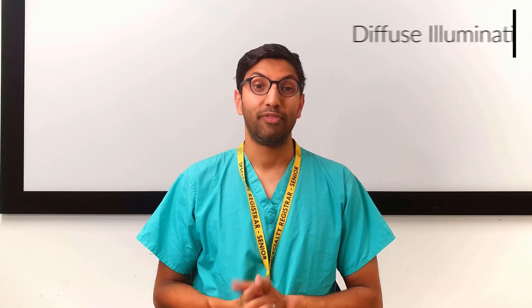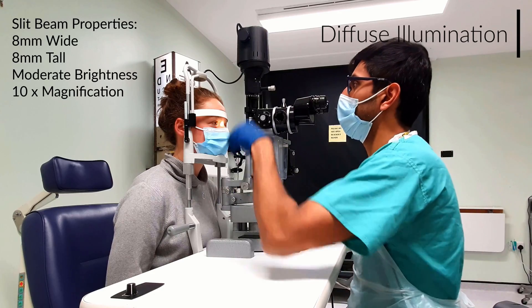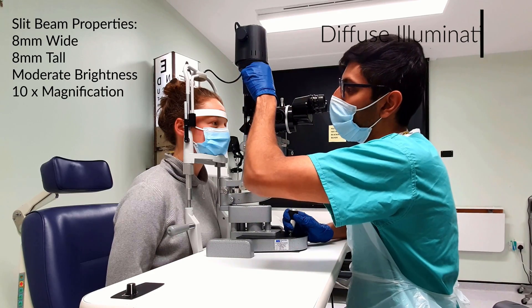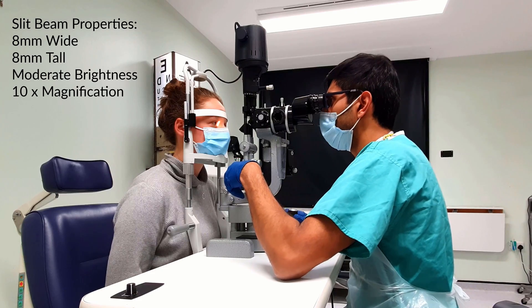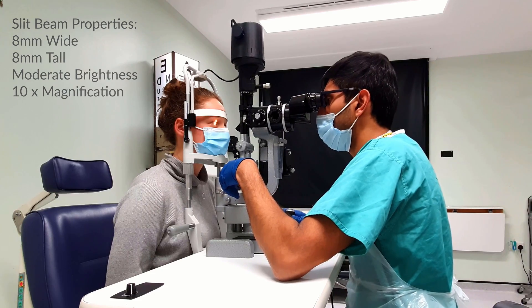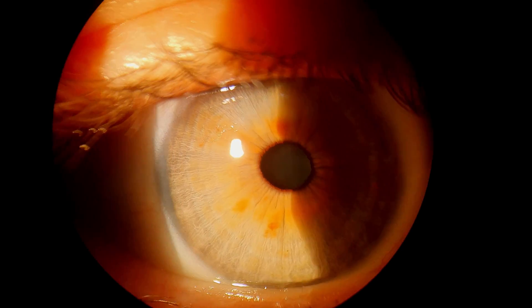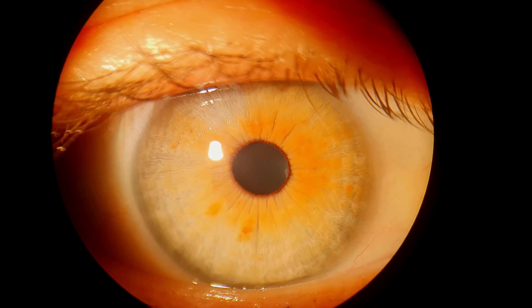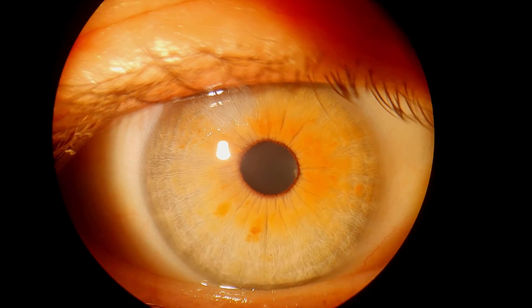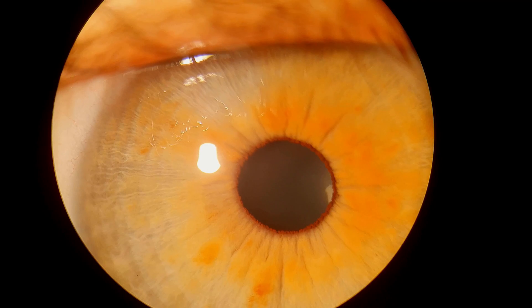Let's start with diffuse illumination. You should use a wide, tall beam with a moderate brightness with about 10 times magnification. This technique can be used to detect gross abnormalities by evenly illuminating the anterior segment.